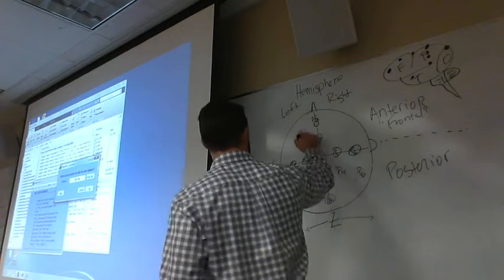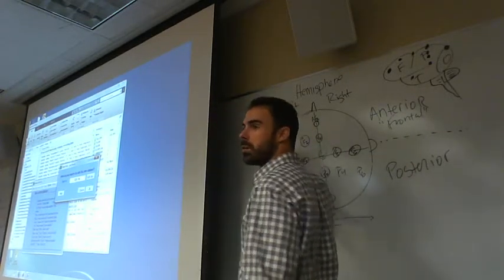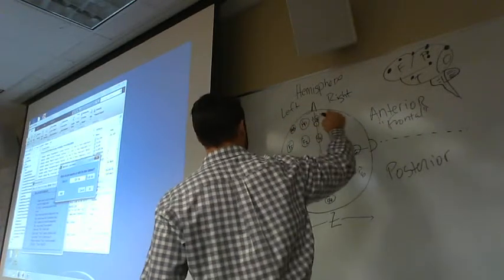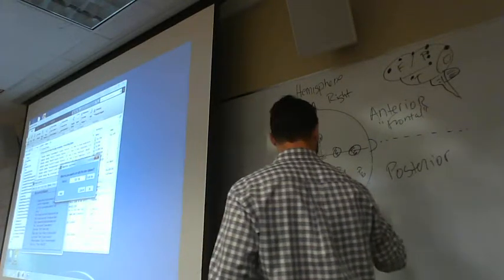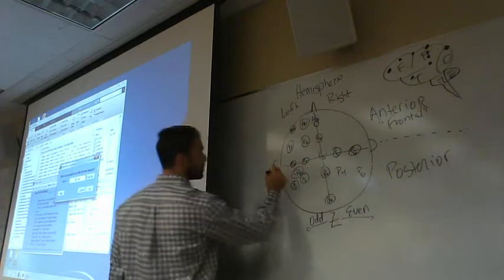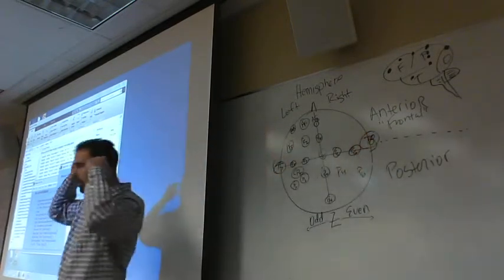Now here you could have F3, say F5, that's not a tornado, that's an electrode site, and you can have anterior frontal as well, AF1, say AF3, etcetera. So when you move here, it's basically our odd numbers to the left, and we have our even numbers to the right. And that's as you move from the midline out laterally. And of course, there's also temporal electrodes. So you have, say, T7 and T8, all the way out here. It's going to be right there.